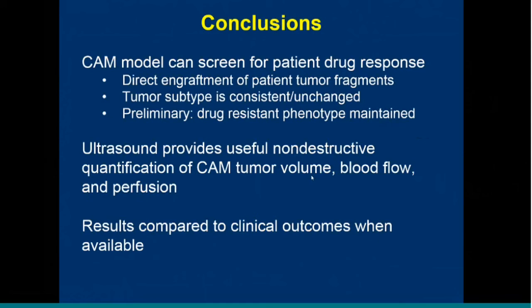And so this brings us to the conclusion, where we note that the CAM model can be used to screen for patient-specific drug response by the direct engraftment of patient tumor fragments. Tumor subtype appears to be consistent and unchanged following the engraftments, and some preliminary results show that a drug-resistant phenotype is maintained following the engraftment on the CAM. Ultrasound is really the modality you want to be using if you're doing any sort of CAM xenograft work. It greatly outperforms everything that we've tried so far, and it provides useful non-destructive quantification of tumor volume, blood flow, and perfusion. And the results of the study will be compared to clinical outcomes when those become available.